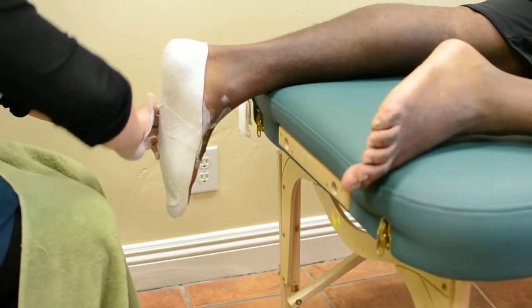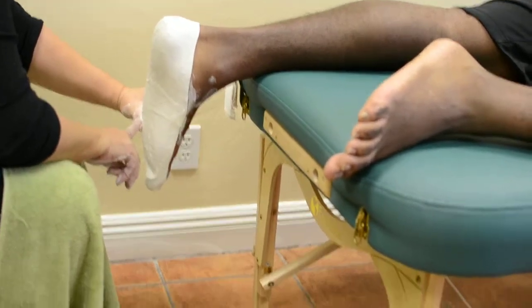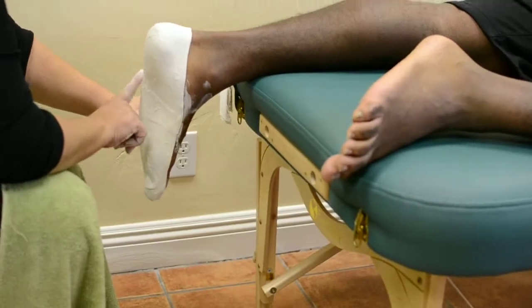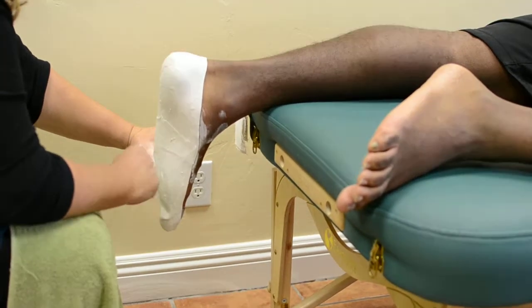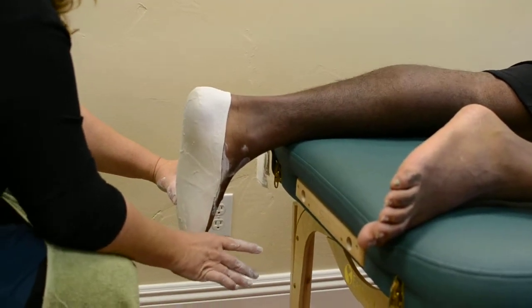Okay, so once I've got the plaster over the heel and then up in the forefoot and wrapped, I'm loading the 4th and 5th metatarsal head here, which is basically simulating the ground reaction force. Because my 5th metatarsal shaft operates independently, my 4th is attached to my 3rd and my 2nd, and the 1st we kind of just like it to do what it's going to do, so we don't apply any pressure on it. Okay.